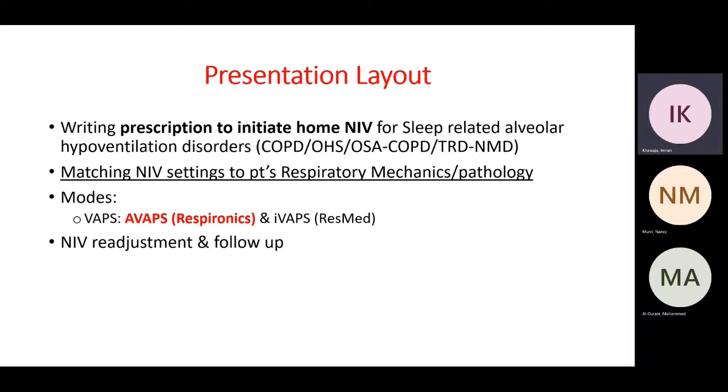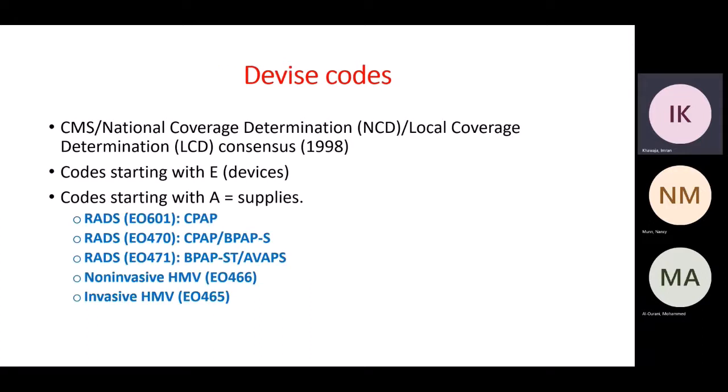I want you also to think about it as a mechanical ventilator that you start on a patient in the ICU, because we don't start people on it and just walk away. We do serial ABGs, and sometimes we have to change settings every day to make sure the patient is breathing well and the ventilator settings are safe, protective, and effective. We're going to do the same thing, with some variations, when we see them in clinic, to make sure that the prescription we wrote is working for them. So I think you need to request these slides and keep them handy when you write prescriptions. I'm not going to go through the details, but they have everything you need.